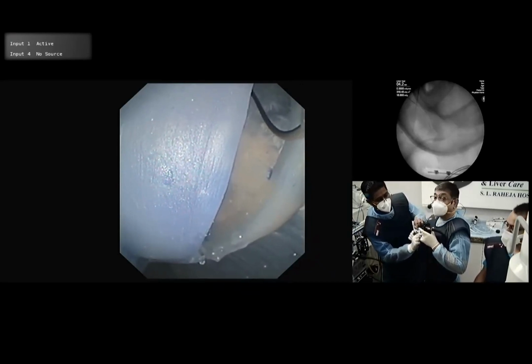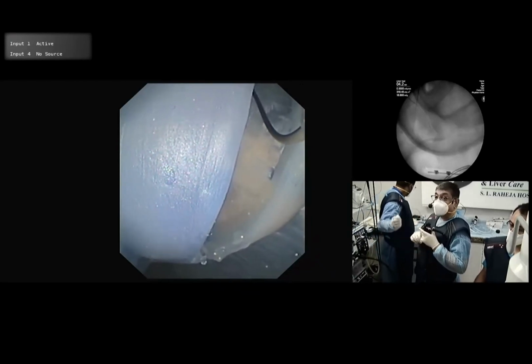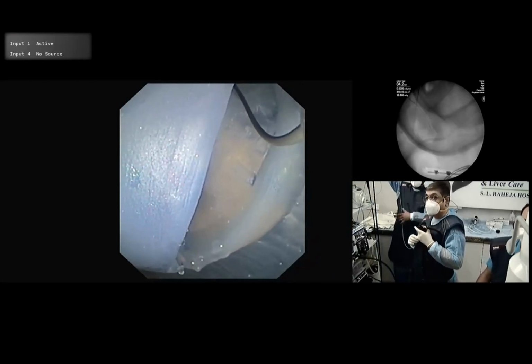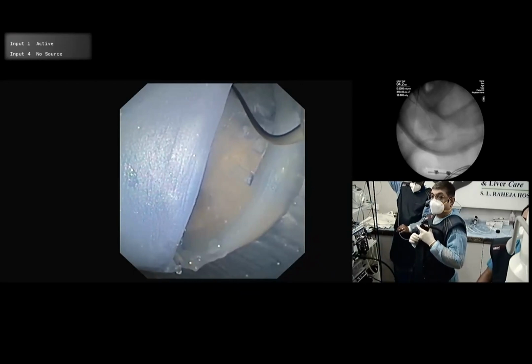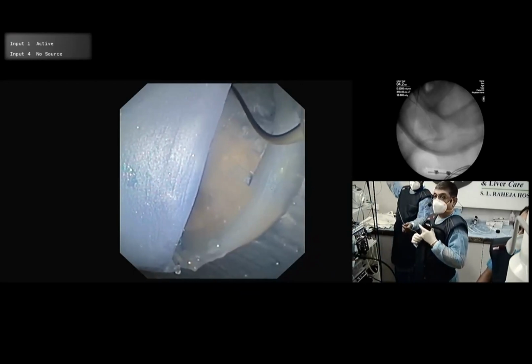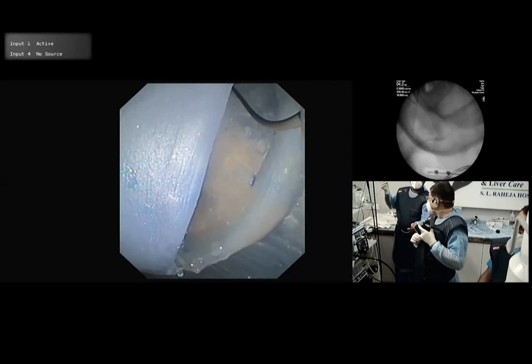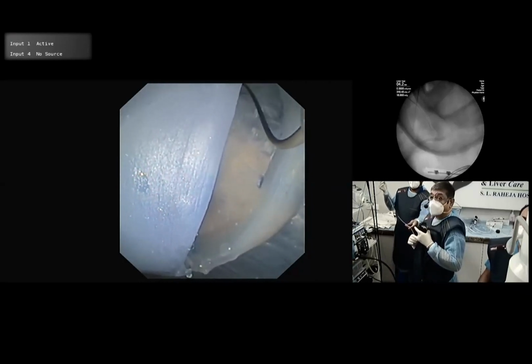It takes time. So better thing is, you see this wire coming out of the papilla. So put your sphincterotome by the side and cannulate. If it's going inside, take a bigger one, take a 7 French dilator, let it go. Okay.